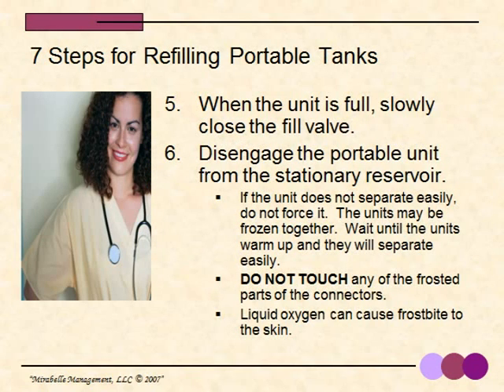Number 5, when the unit is full, slowly close the fill valve. Disengage the portable unit from the stationary reservoir. If the unit does not separate easily, don't force it. The units may be frozen together. Wait until the units warm up and they will separate easily. Do not touch any of the frosted parts of the connectors. Liquid oxygen can cause frostbite to the skin.